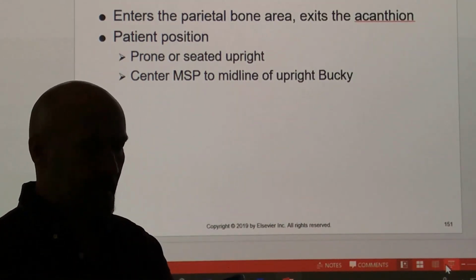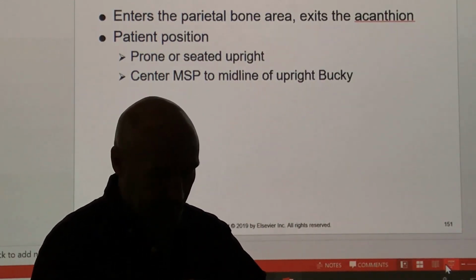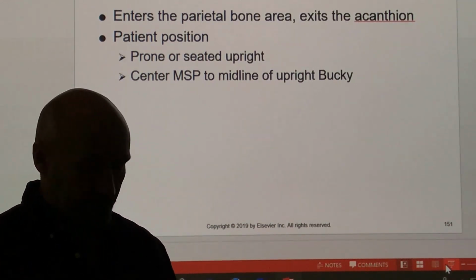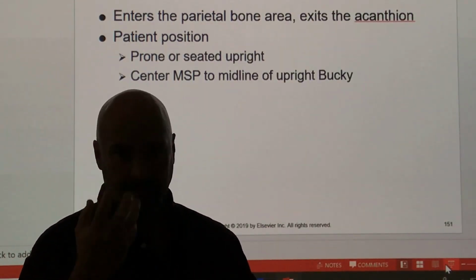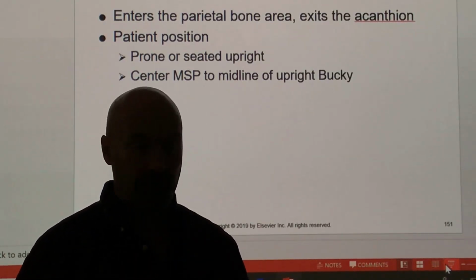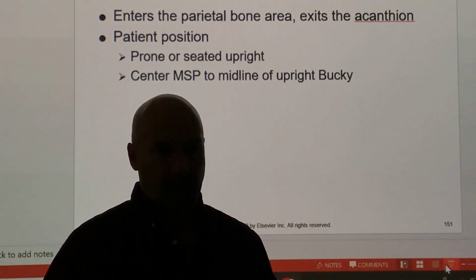The importance of this is that if we have a blowout fracture, again, it's a very thin bone. It's hard to make a diagnosis of blowout fracture, but you can see evidence of it. The patient gets hit in the eye, let's say with a tennis ball, and the eye tries to compress, but it's full of fluid and it can't compress. It blows out the floor of the orbit.